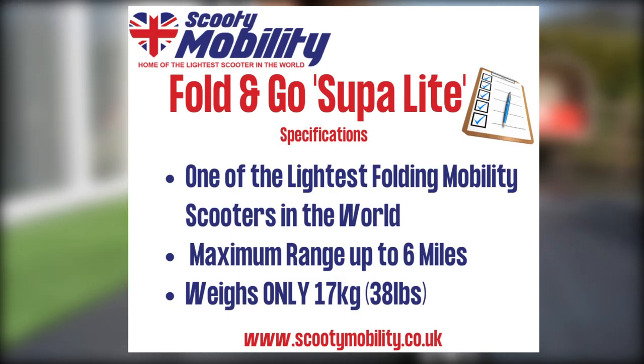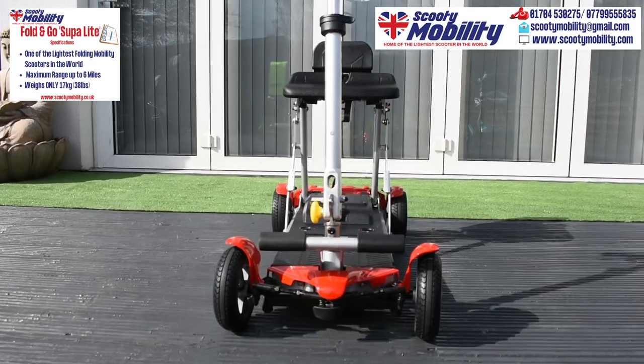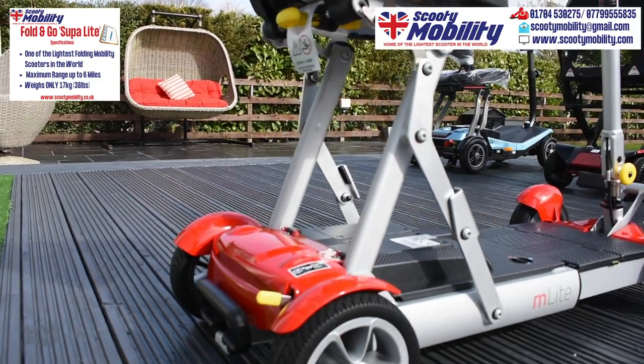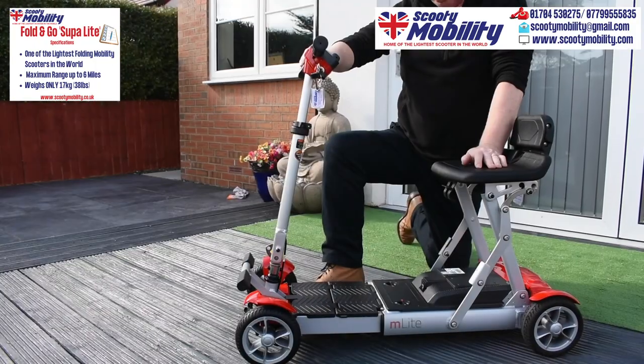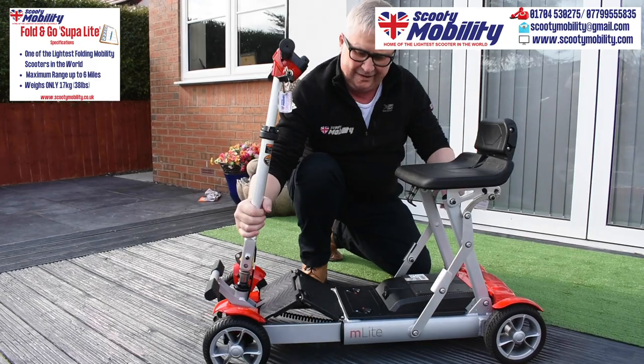So this Superlite is a brand new scooter for us, just arrived. If I seem a little bit clumsy folding and unfolding it, please excuse me — this is only the second time I've folded and unfolded this scooter. We're really pleased with it, it's come out really well. It folds up very easily. Remember, this is only my second attempt, so I might fumble a little bit.